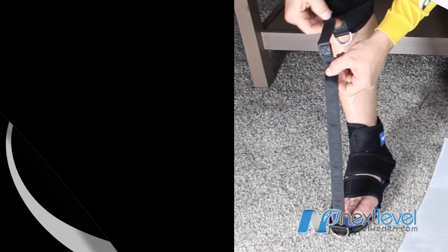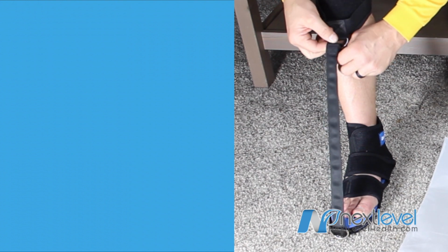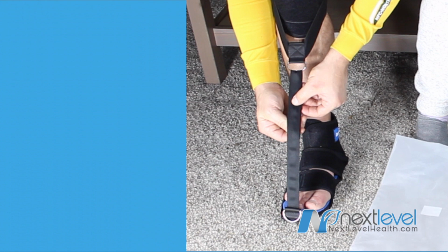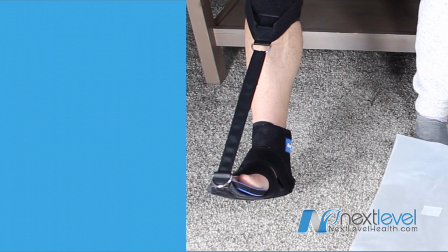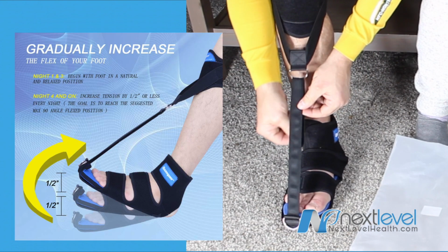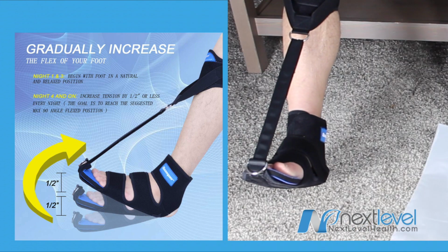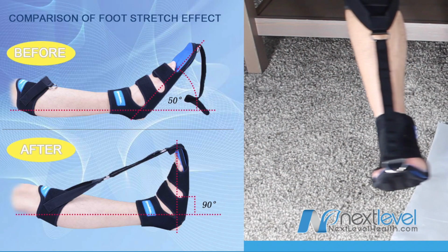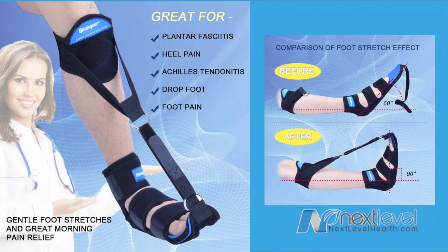So the first way to attach this is to stick the fuzzy side through the metal loop on the top where the calf strap is, and then just simply secure it to your tension. You want to tighten it so it's tolerable but not painful. Remember, we're trying to stretch the calf as well as the plantar tendon, and we want to do this comfortably enough so that you can sleep with it on.